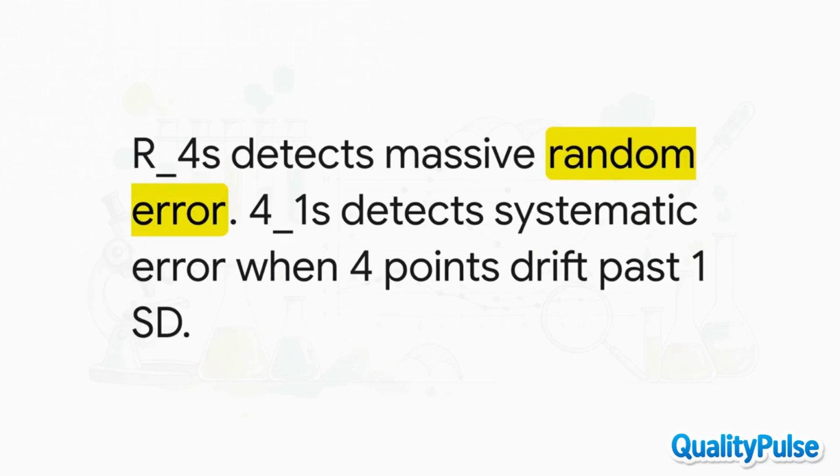Next up, we have 2 more rejection rules. First, the R_4S rule, which detects massive random error. This triggers when the range between 2 controls in the exact same run exceeds a massive 4 standard deviations. Say, one control is up at plus 2 SD, and the other drops all the way down to minus 2 SD. Then we have the 4_1S rule, which spots systematic error. This happens when 4 consecutive points slowly drift and just stay past the 1 SD line on the same side of the mean. Both of these rules mean you absolutely have to reject the run.